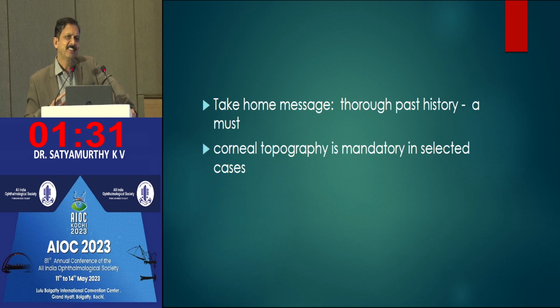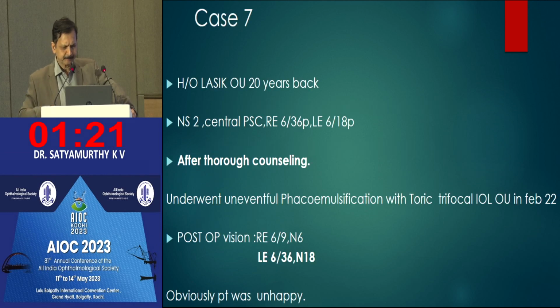In such selected cases, it is always better to do corneal topography pre-op, so that counseling would be better. Otherwise, you'll land in trouble and your chair time will increase. Another case where LASIK was done about 20 years back, and probably in the future this is going to be the thing. We also always ask the patient.